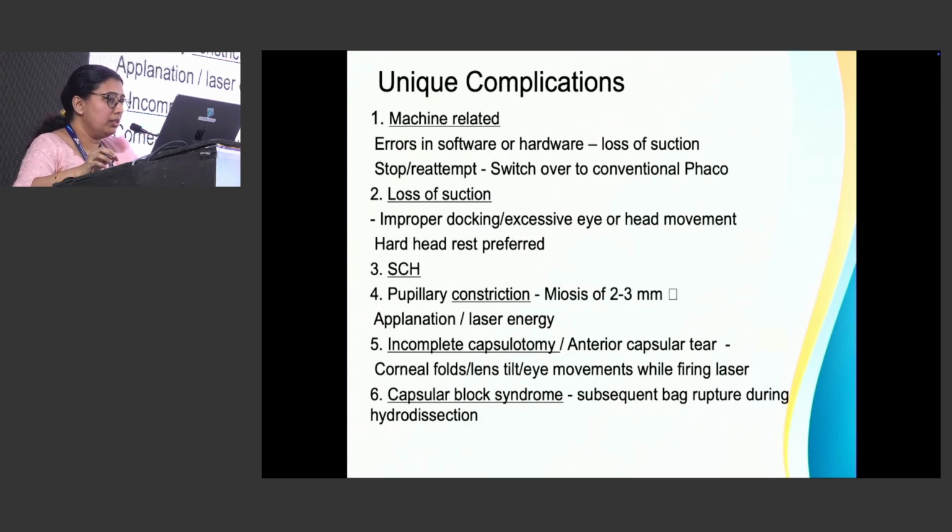Unique complications are machine related. Any error in the software can cause loss of suction. We might need to stop or reattempt and switch over to a conventional phaco. If there is improper docking or excessive eye movement, again loss of suction happens.